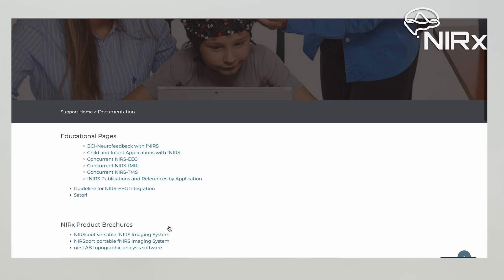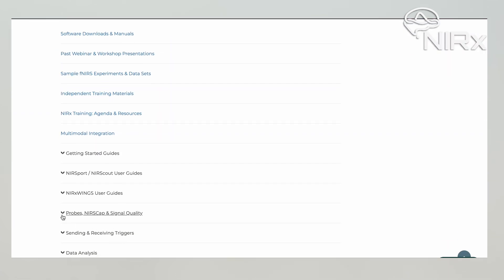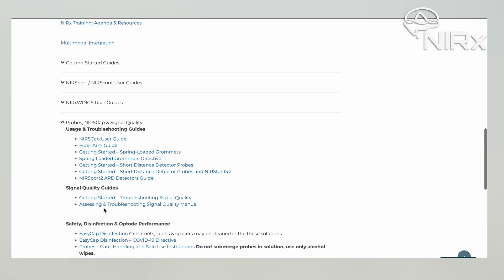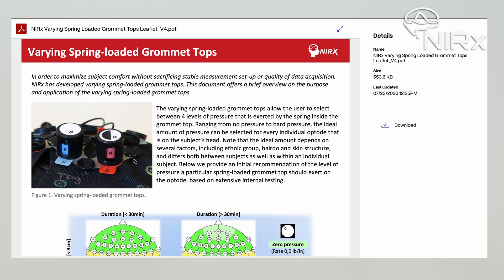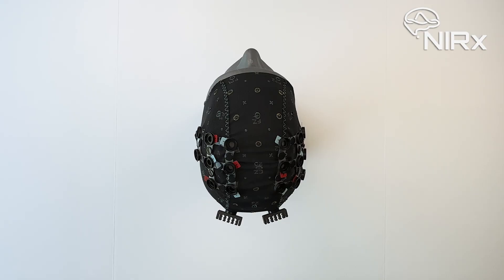Nirex provides suggested guidelines for spring cap tension usage based on protocol duration and optode location on the cap. However, deciding which spring top to use at each optode location is subjective for each participant. Consider factors such as the participant's hair density and length. Once you have decided on which spring cap tension to use for your montage, it's time to begin populating your cap.